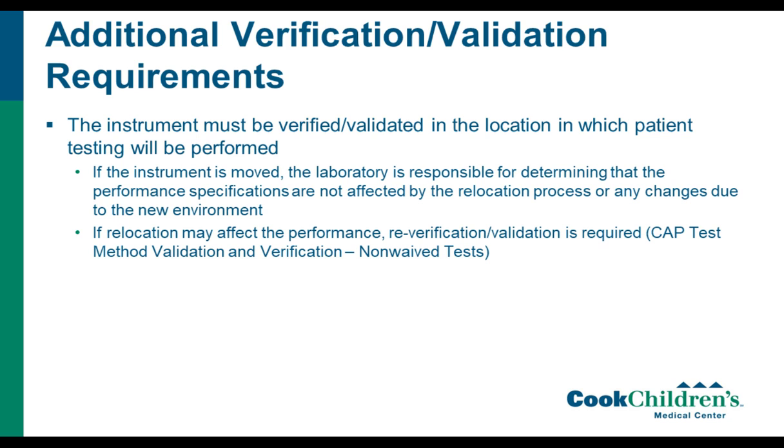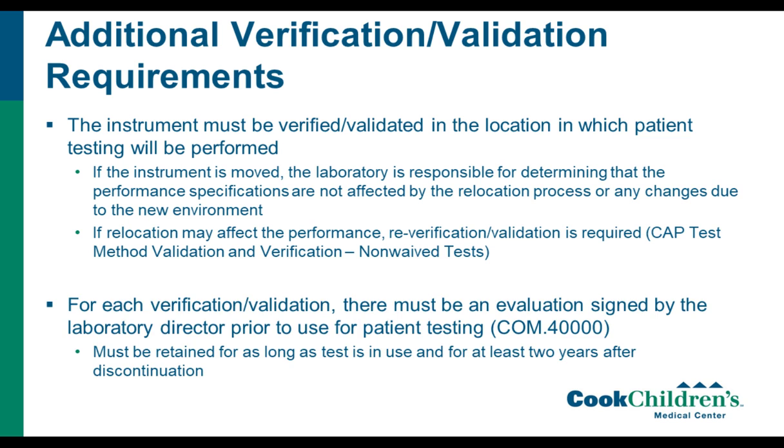revalidate. And so as an example for this, a new tower in our hospital was built a couple of years ago, and we moved, and it was a completely different kind of building or section in the hospital, and so we revalidated, re-verified all of our assays.